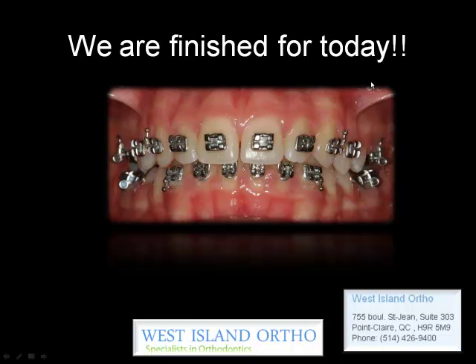So that's basically a very straightforward procedure if you're patient. All the brackets have to be positioned as straight as possible to make sure that your teeth will be as straight as possible. Thank you.